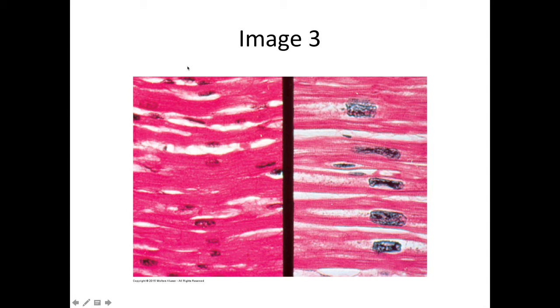On the left-hand side of the image right here, this is a normal size of myocardia. The tiny little darker circles are going to be the nuclei, whereas when we go to the right-hand side of the screen, and I'm circling some of these guys, these have a very characteristic name. The nuclei enlarge in cardiac hypertrophy because we are sending signals to make brand new sarcomeres, so we have this increased expression of protein production. And so these are called boxcar nuclei. So what you're looking at here are called boxcar nuclei. And again, this is a telltale sign that the individual has hypertrophy of some sort.